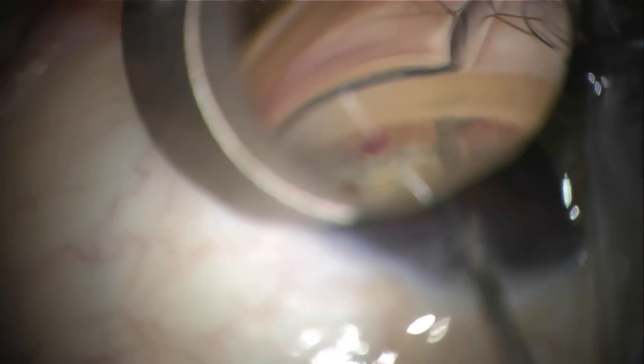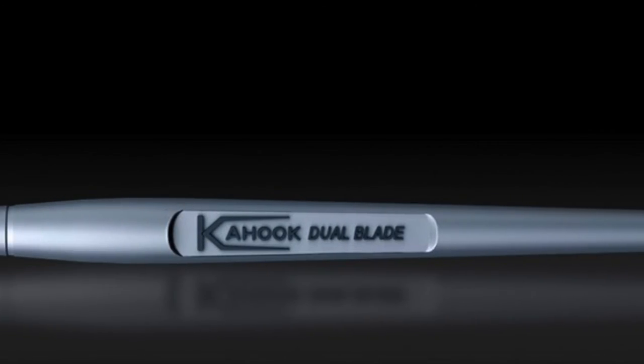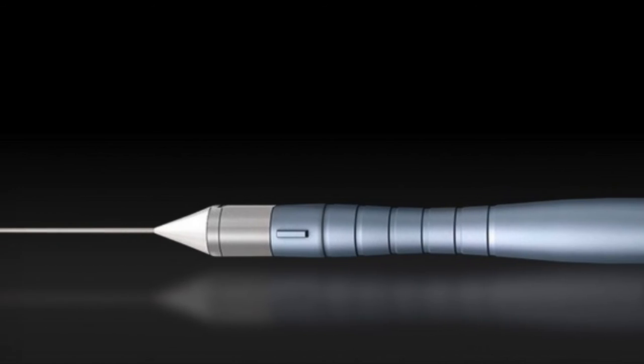The blade is then repositioned to pierce the TM at a different location towards the direction of the initial incision. This will make a connection that allows for removal of the TM in a clean sweep. This is then repeated on the other side for approximately 120 degrees. The Kahuk Dual Blade is a single unit device that is disposable.